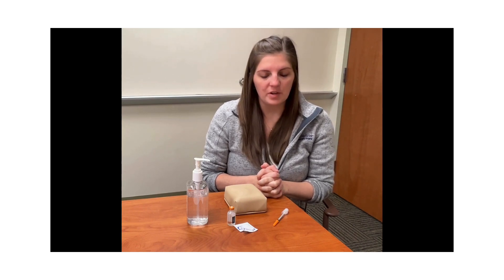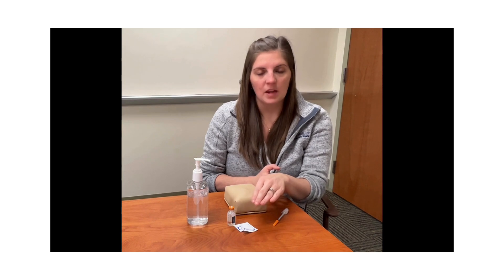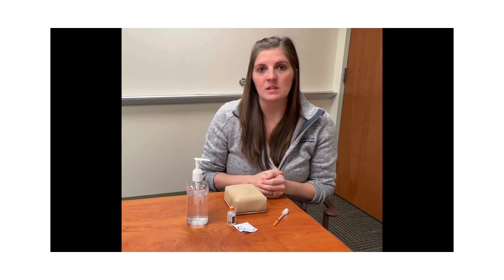In front of you, you need to have your syringe, alcohol either by an alcohol pad or rubbing alcohol with a cotton ball, as well as the insulin you intend to use. If you take two different insulins by vial, you need to make sure that the insulin you intend to take is in front of you.